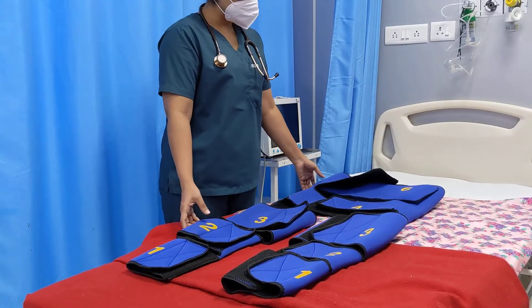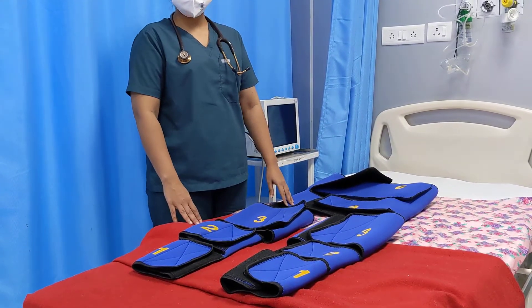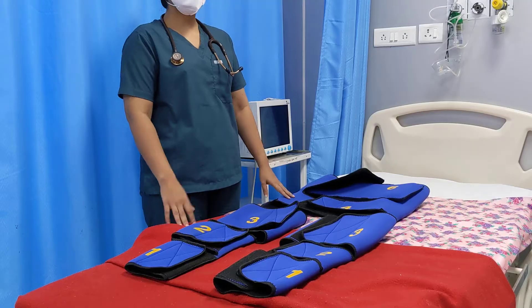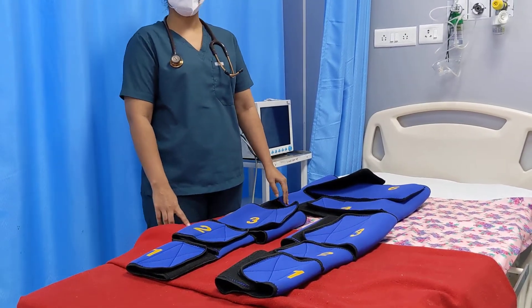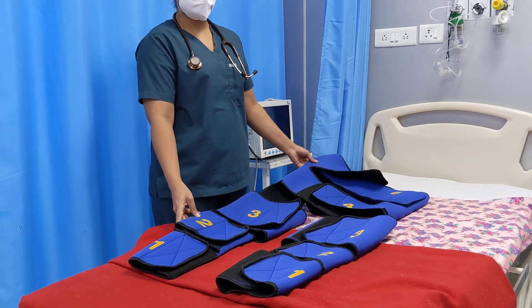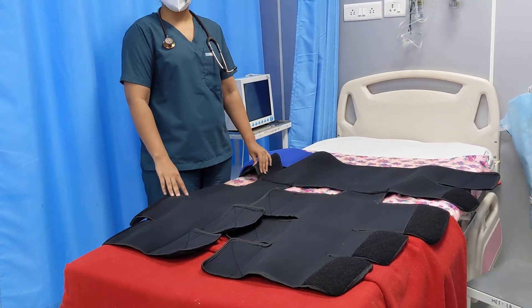Now let's demonstrate the application of this garment on a patient. It's important to note that with a little training, this garment can be applied by anybody — we do not need a doctor per se. Even a paramedic, a driver, or even a relative of the patient can learn to apply it. Application of this garment takes only 2 to 3 minutes.